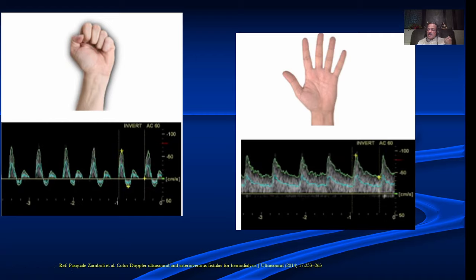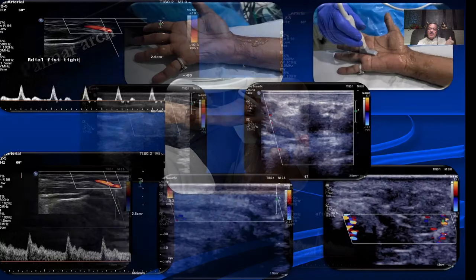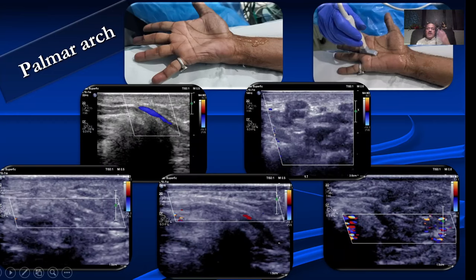Here we are looking at the radial artery — the fist is tight and we can see a high resistance waveform, in fact a reversal of flow. After releasing the fist, there is reactive hyperemia and we can see an increase in diastolic flow. This is a normal response.